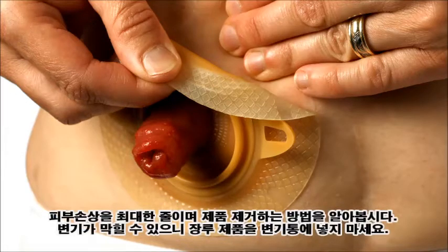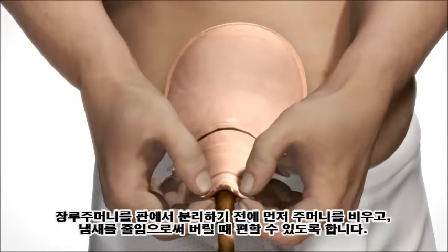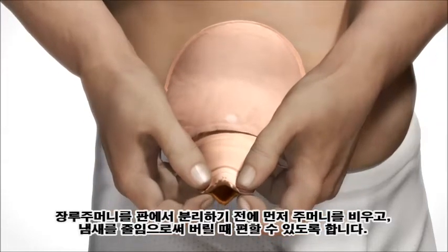Let's have a look at how to remove your ostomy appliance in the most appropriate way in order to protect your skin. Always remember not to flush any ostomy appliances in the toilet as they might block the sewer system. Before removing the bag, you should empty it to ease removal and reduce bad smells and soiling from the bag when being disposed of.